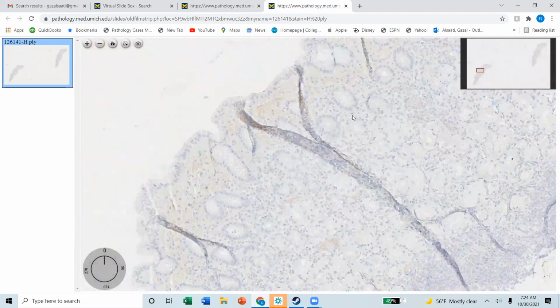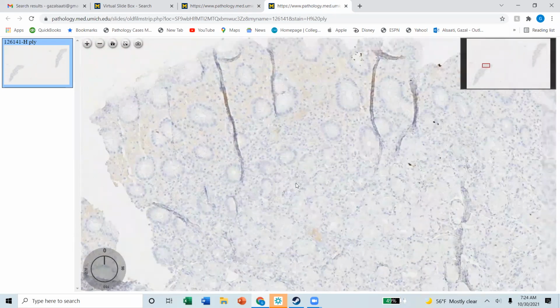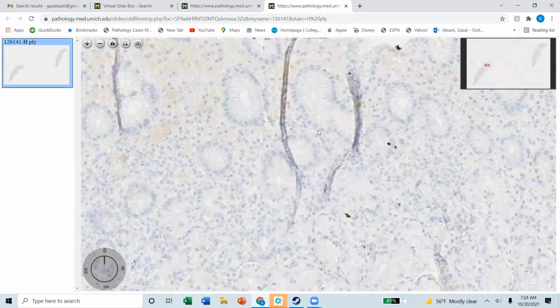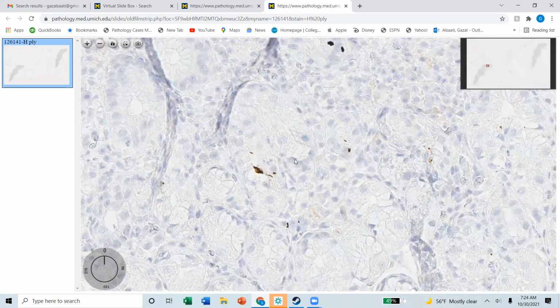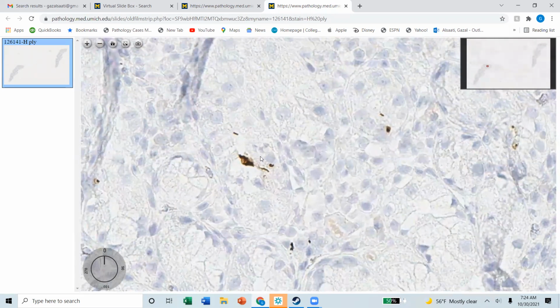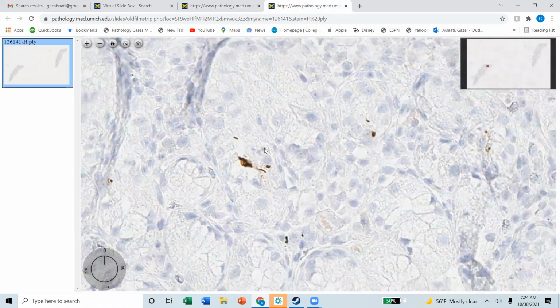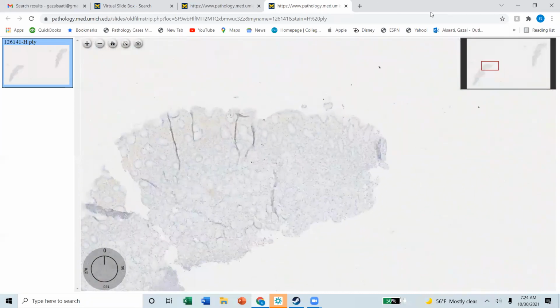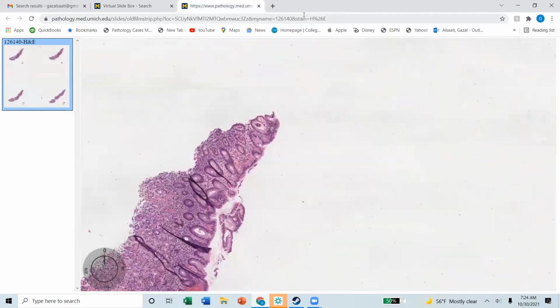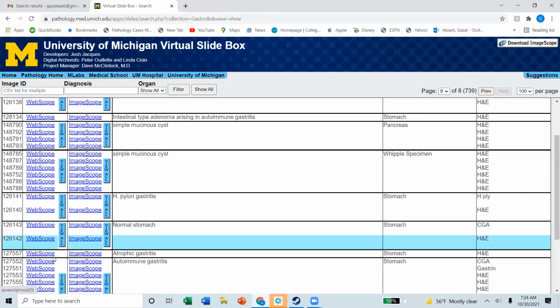And that's exactly what I'm saying. Squeeze yourself to find it. They are there. They are. Okay. It's not loaded. I'm pretty sure you've seen H. pylori stains that are everywhere. But these are here, the H. pylori organisms, and they are deep in the pits as expected. Okay. And okay, normal stomach.